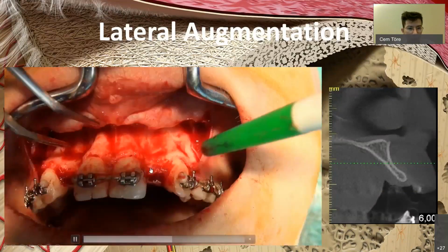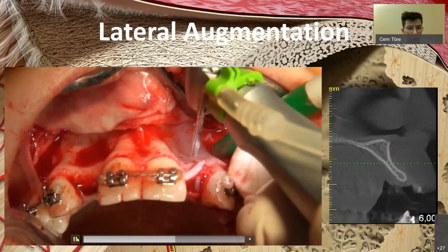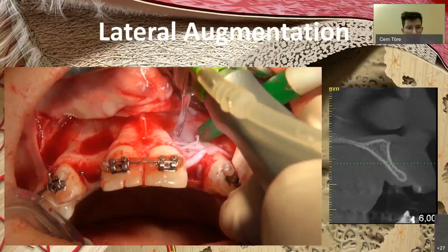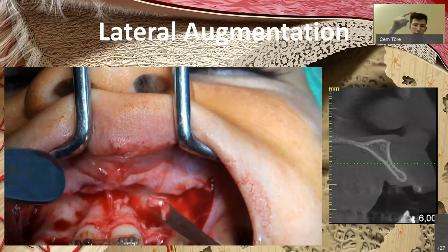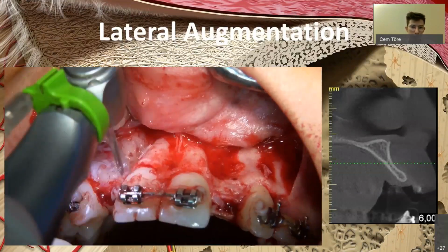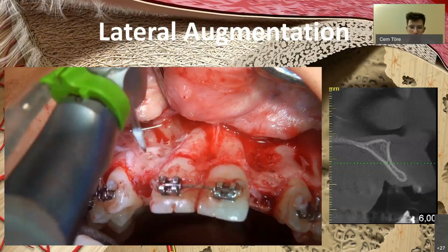You can see how thin the bone is in the area. We are decorticating the bone, which is mainly making sure we have tunnels from the native bone going to the graft for the angiogenesis to happen, to ensure the graft has a blood supply to heal.